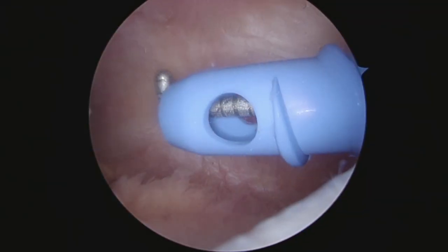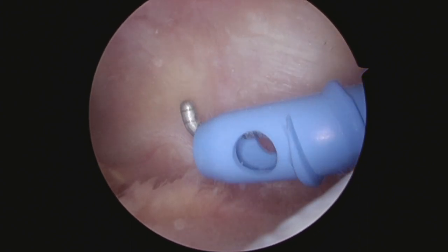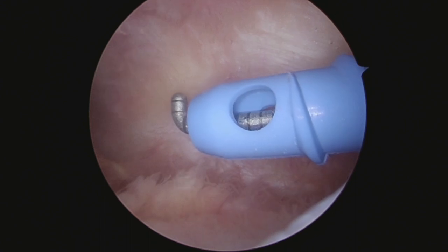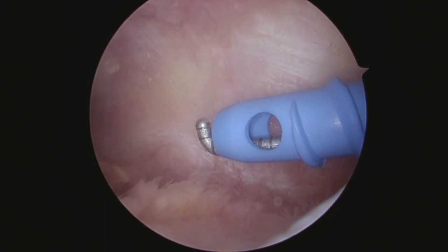Okay Roselle, this is Dr. Eisenberg and the team. We just got into your knee joint here. What you see in front of you is a blue cannula taking fluid outside the joint. Out of that blue cannula is a probe. That probe is 1 by 3 millimeters at the tip. That hole in the cannula is 3 millimeters in diameter, just to give you an idea of magnification.